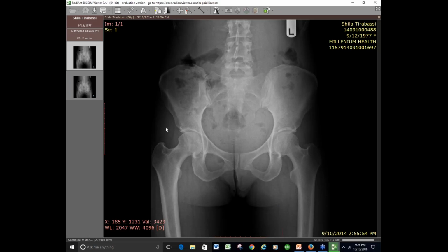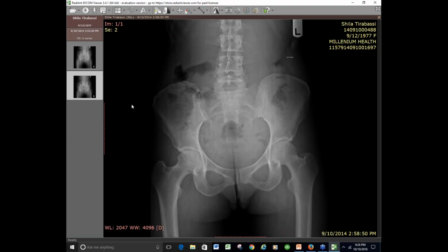All right, so let's see what should show here. Okay, so here's a good example. This is actually one of our therapists. Many of you know Sheila. Sheila's great. We love Sheila. So Sheila, let's go ahead and do this one more time just to show you. Deviation tool. Sheila also has a pretty significant leg length inequality. If you don't know her story, she was a dancer for many years and had to quit with all these issues.